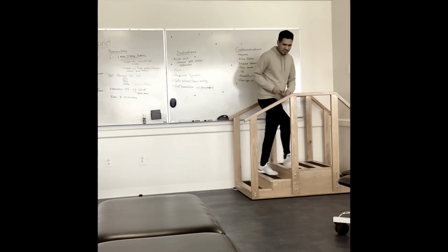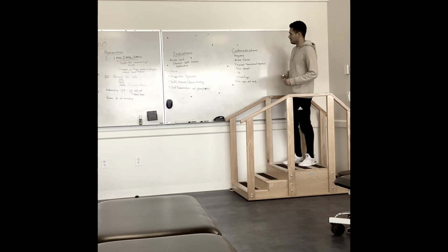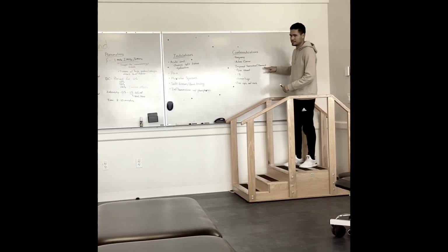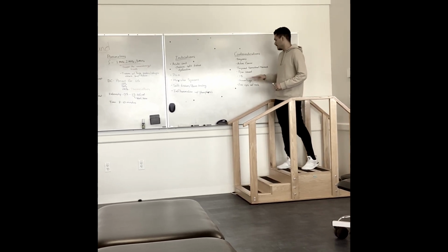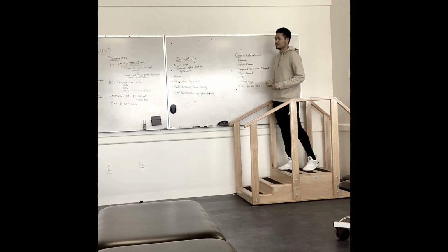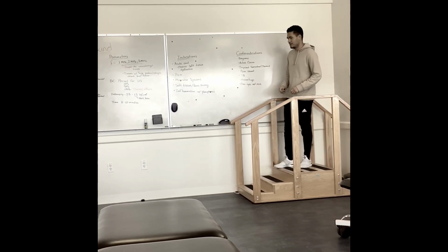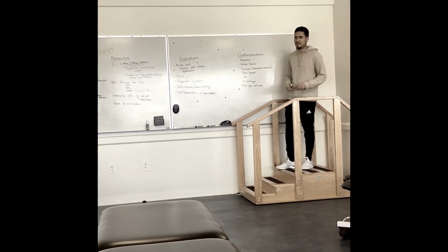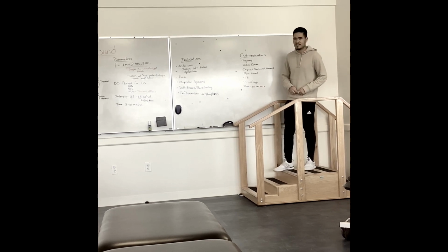And last but not least is the contraindications. For contraindications, we've got our main ones once again: pregnancy, active cancer, impaired sensation, especially for thermal, you want to be careful of that, and open wound. And for ultrasound, you also have to be careful of tuberculosis, if they're hemorrhagic, and you don't want to use it over sensitive areas that don't have a lot of skin, such as over their eyes and neck. And that's it for ultrasound.